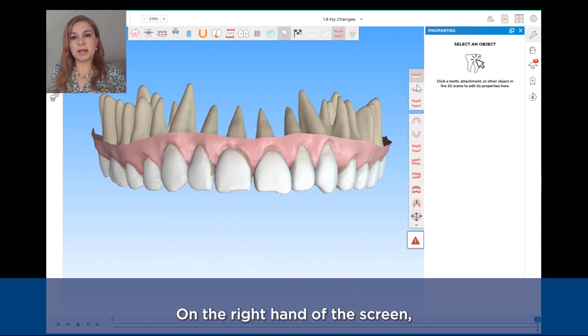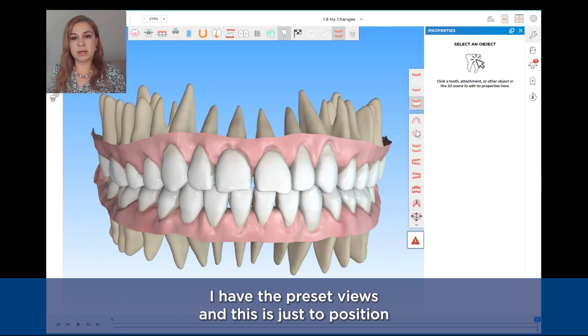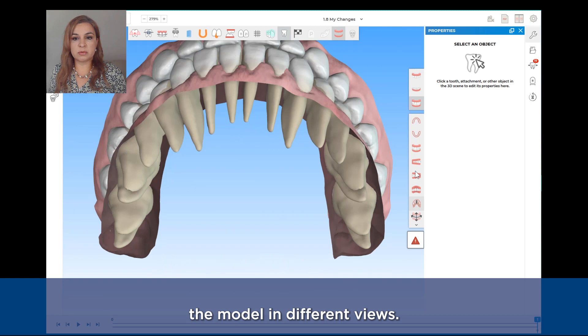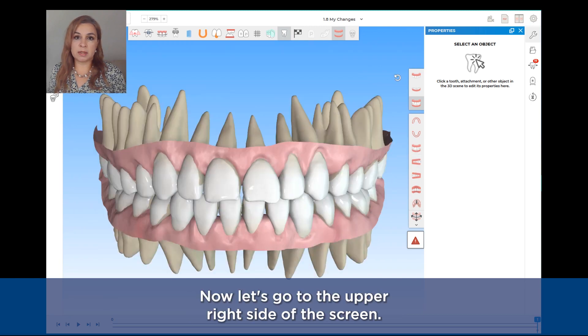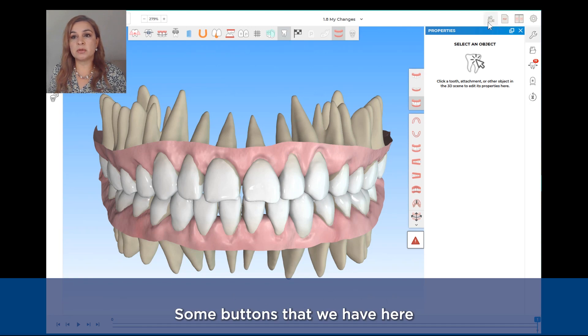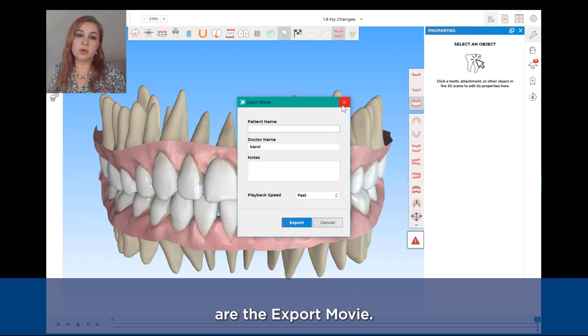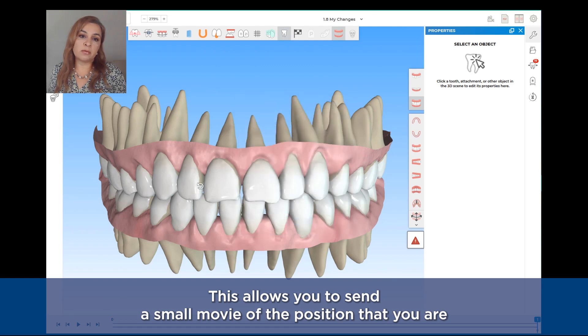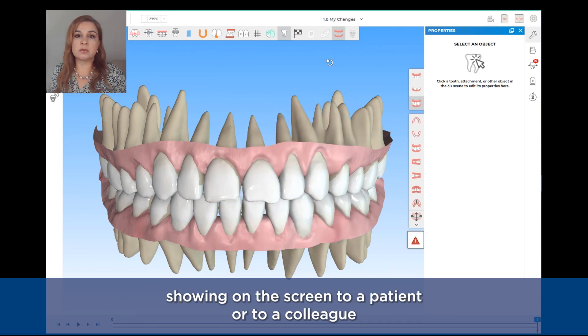On the right-hand side of the screen I have the preset views, which is just to position the model in different views. Some buttons on the upper right side of the screen include the export movie. This allows you to send a small movie of the position you are showing on the screen to a patient or to a colleague.